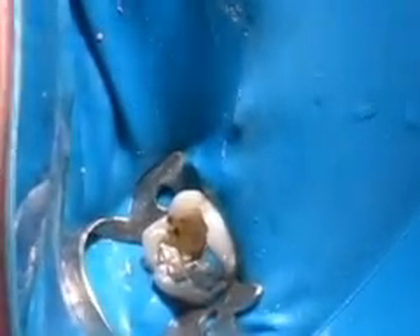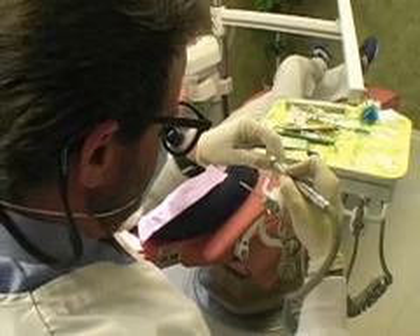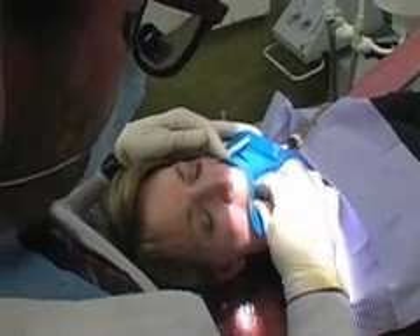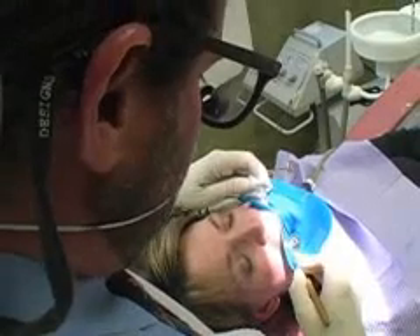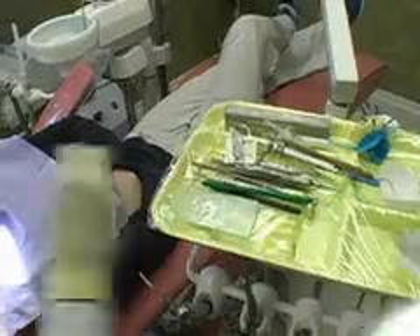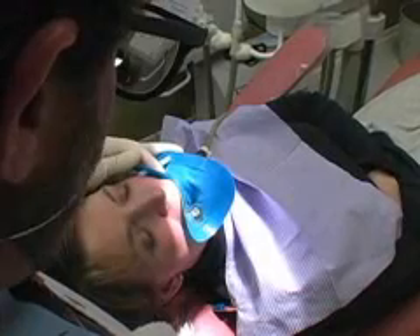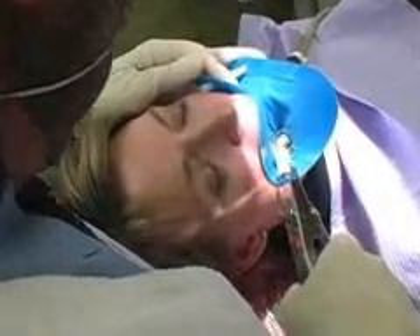Then we place the post in the back root — the big root. I'll drill into the root canal space, remove some of that rubber, and place a titanium post in the back root, then cement it in. That helps give the tooth strength because you've hollowed the tooth out by doing root canal and need to build it back up. I'm screwing the post into the back root, then I'll place a hard filling over top — I'm using something called Fuji 9, which will quickly seal the inside of the tooth and place a large filling over the post.